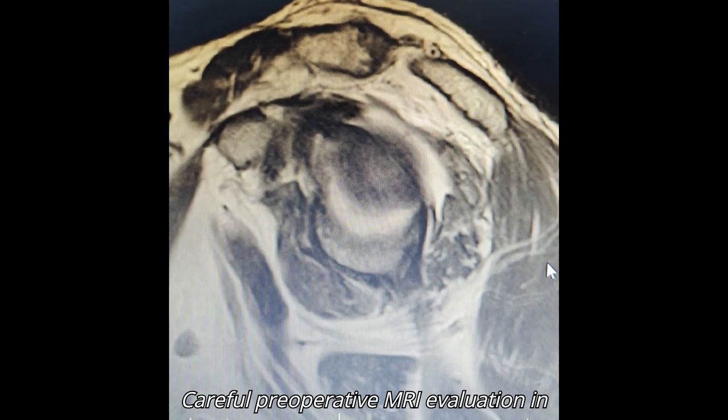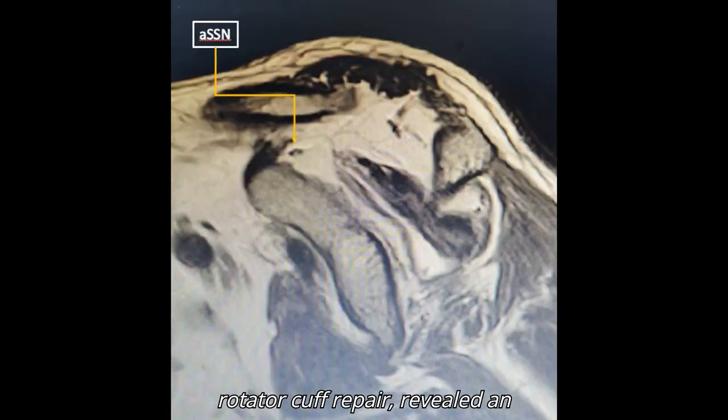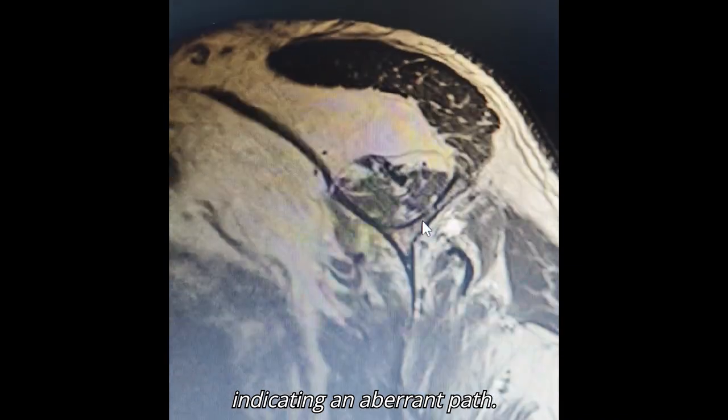Careful preoperative MRI evaluation in this patient, scheduled for arthroscopic rotator cuff repair, revealed an unusual anatomical variation. The suprascapular nerve was seen coursing above the transverse scapular ligament, indicating an aberrant path.